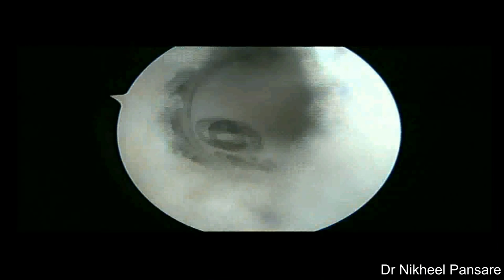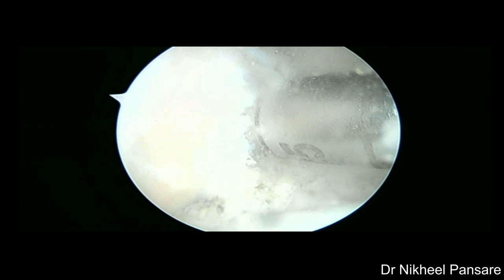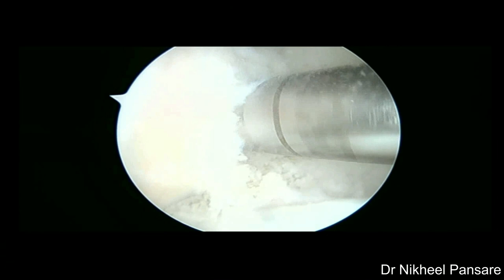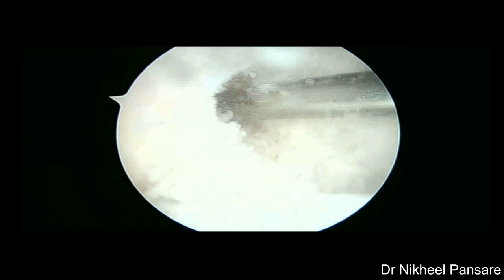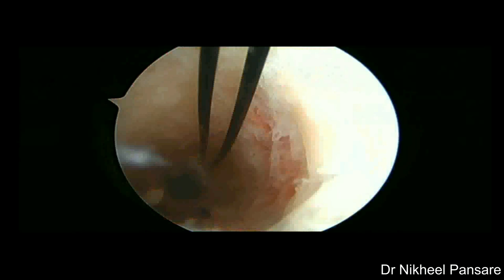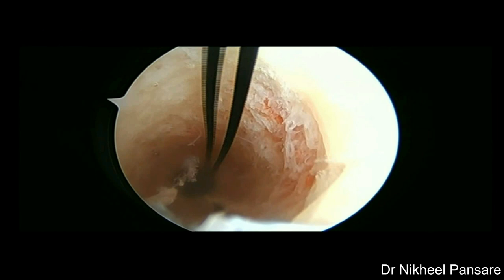Over-drilling completed up to 25 mm using 9 mm drill bit. Loop ethilon is passed over with the pin and tied outside. This is how the femoral tunnel looks with intact walls.